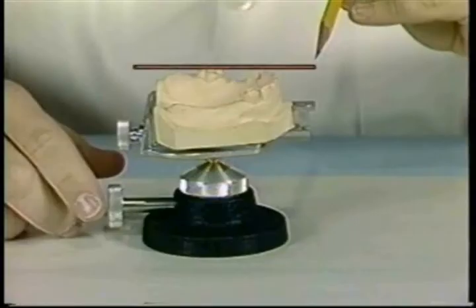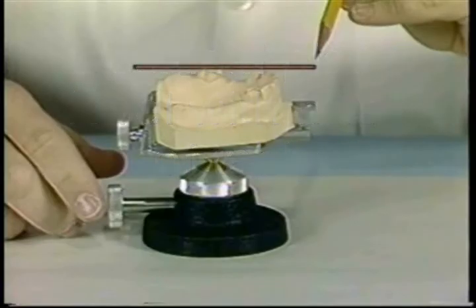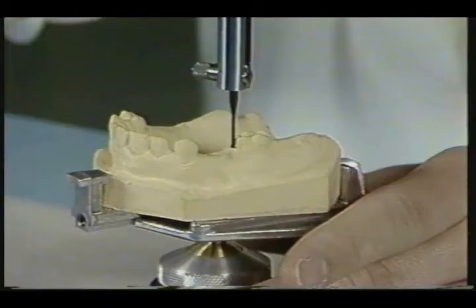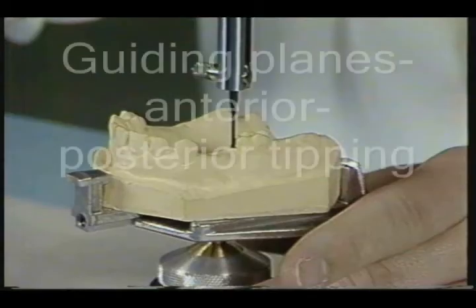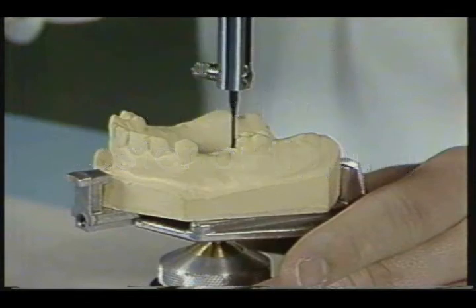Review the steps of surveying. First, secure the cast to the table and the occlusal plane is level with the base of the table. Next, examine the proximal surfaces for their use as potential guiding planes. The cast may be tipped anteriorly and posteriorly to give the best alignment, which results in better conservation of tooth structure.